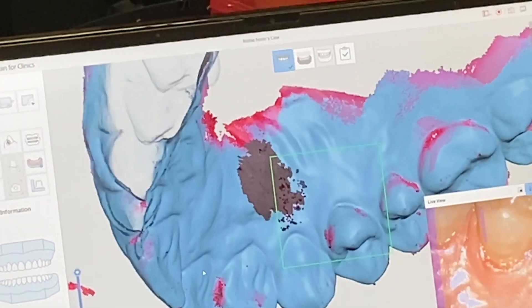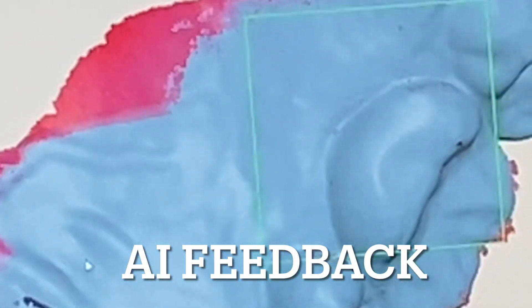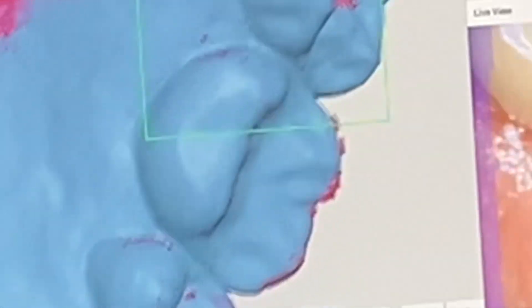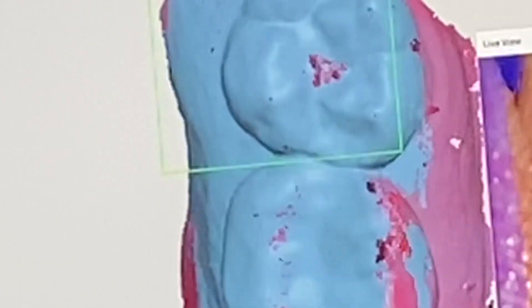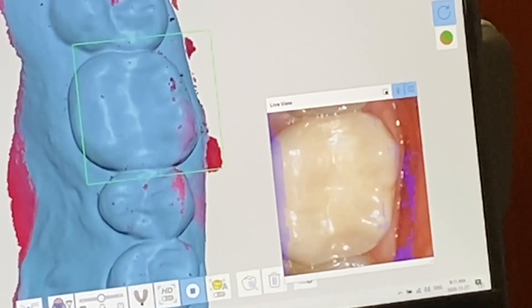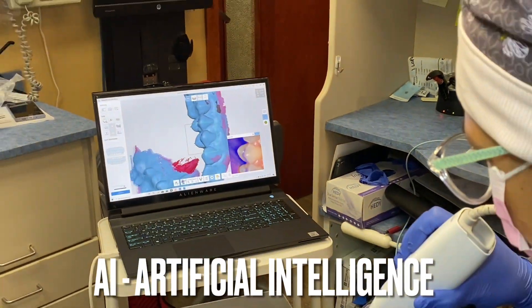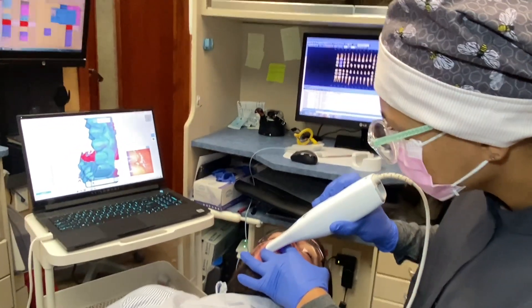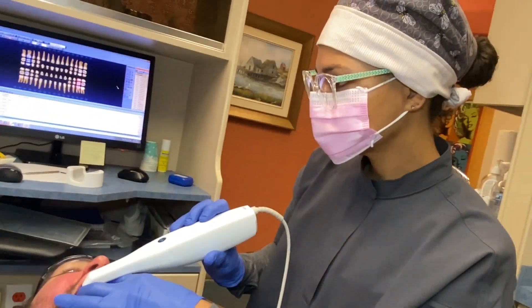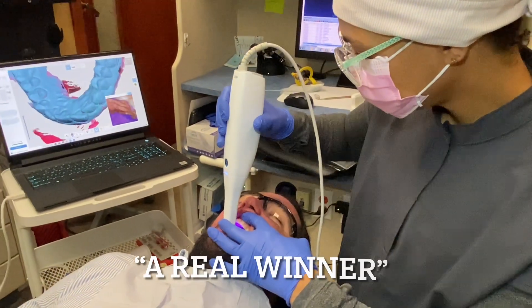Jessica has not had training on the Medit i500, but you'll see she's easily using it. As we go into areas that have a little bit of pink or red, this tells us it needs a little bit more. Watch as she comes around the margin — you can see she's picking this up and the display tells her where to look. The camera can see the tongue but it's not picking it up because the AI knows that's not what we want to scan. This artificial intelligence cleans the scan as it goes, which avoids frustration when the tongue or lip gets in the way.